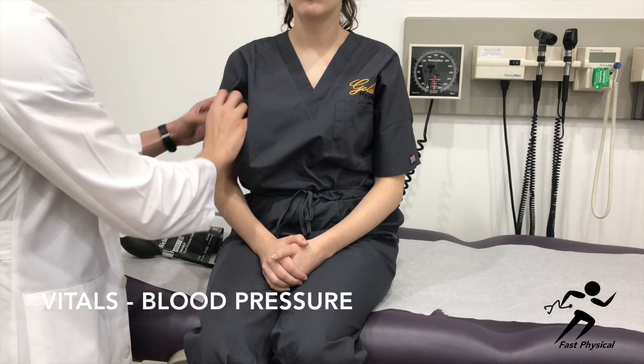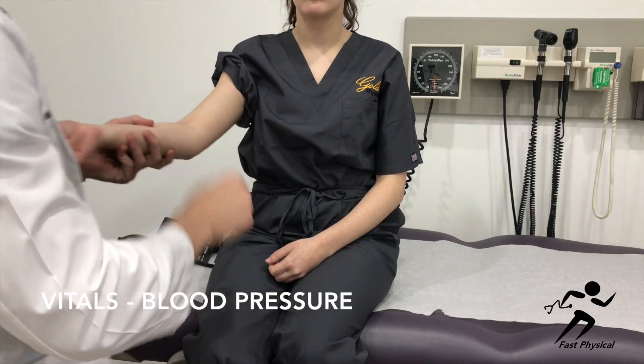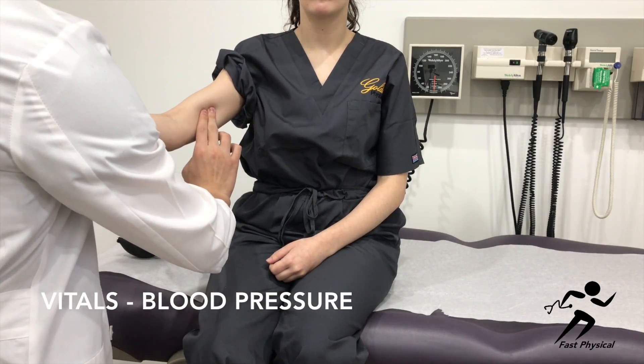To take the patient's blood pressure, first remove any clothing from the arm you are going to use. Next, palpate for the brachial artery.